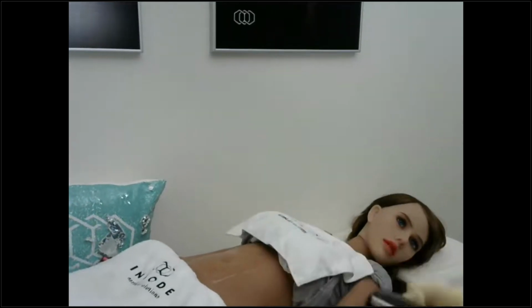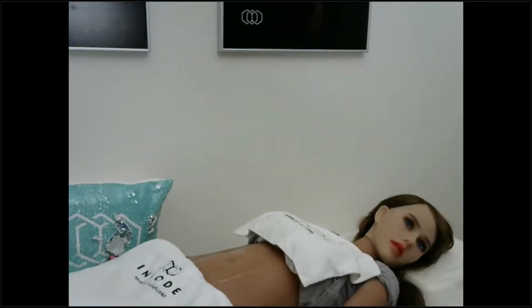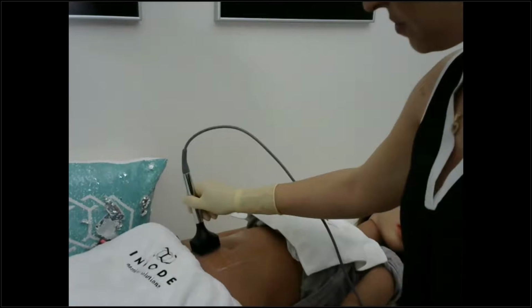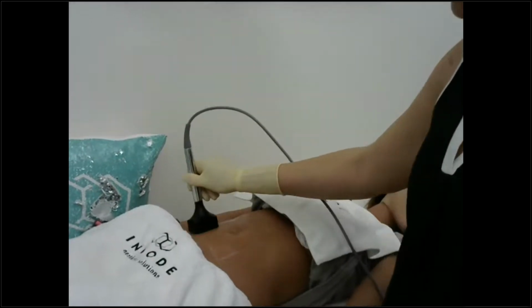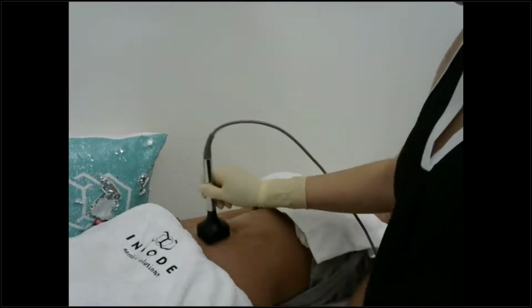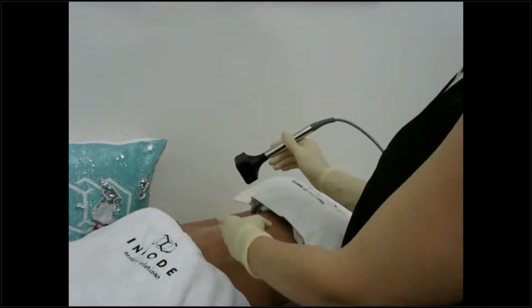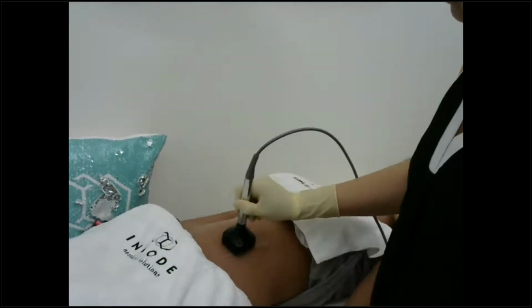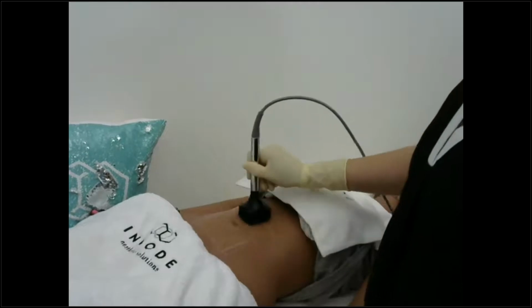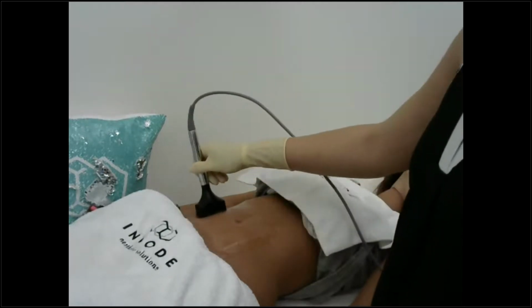Is it possible to actually demonstrate the increasing of the temperature? Sorry, but let's go back to our patient here, and I will not actually give her a treatment, but give you the tips. Especially working on such a defined area like here, it is very important that you're not working in the exact same direction. I would not want to work this way and then go back to the exact same area, because this is already heated up and this is kind of cooling down. So I would want to cover it in a more even way, and then back to the first area, and make sure my entire treatment area is covered again and again.